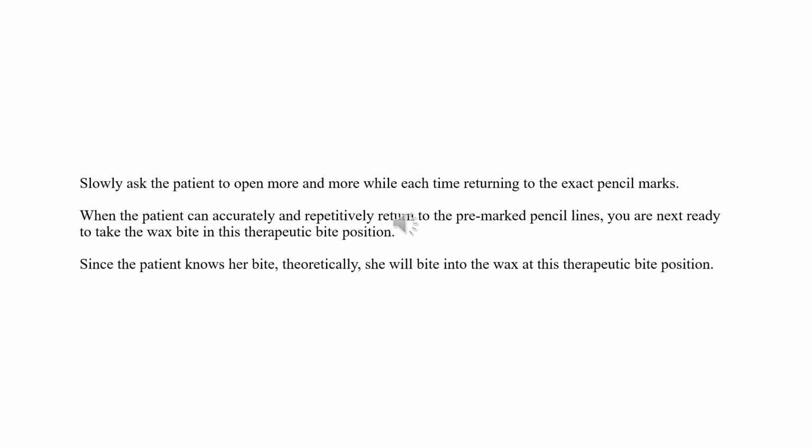Since the patient knows her bite, theoretically, she'll bite into the wax at this therapeutic bite position. But she's going to need coaching when she's biting in the wax position, because there's a whole bunch of stuff she's going to do automatically without her knowledge, and she might screw it up. Now, she's not a bad person, and she's fighting her body, and be careful.